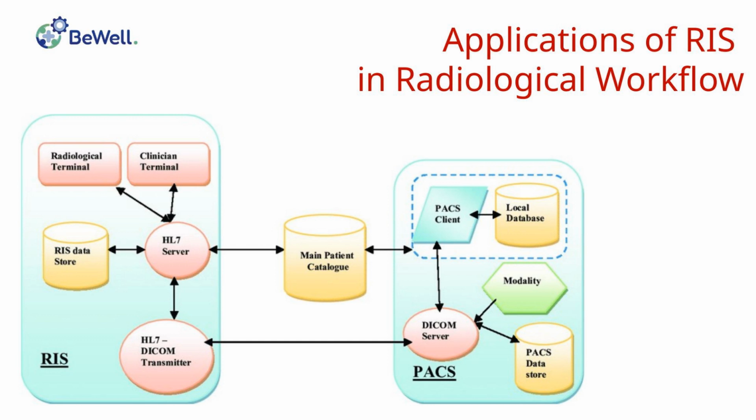Subsequently, the report is placed on an offline storage medium, which is accessible through manual retrieval by an operator who inserts the memory support into a reader. The progressive reduction in the cost of digital memories is leading to a gradual abandonment of offline archiving, with the entire archive of reports being kept immediately accessible.